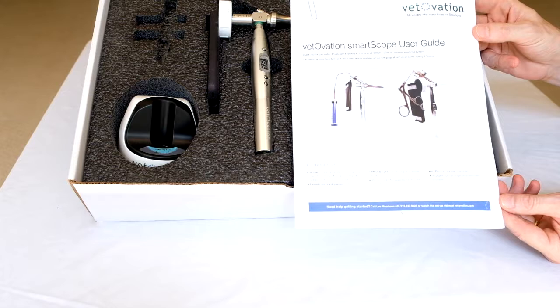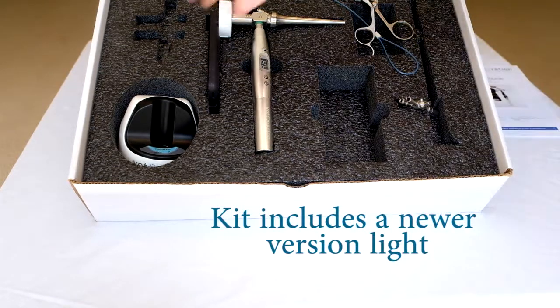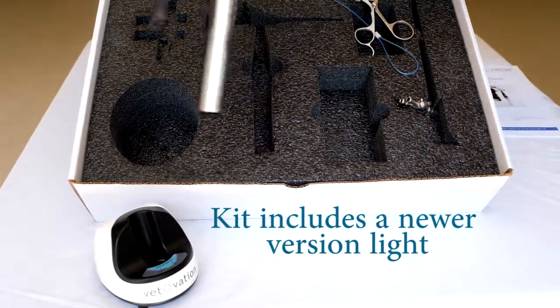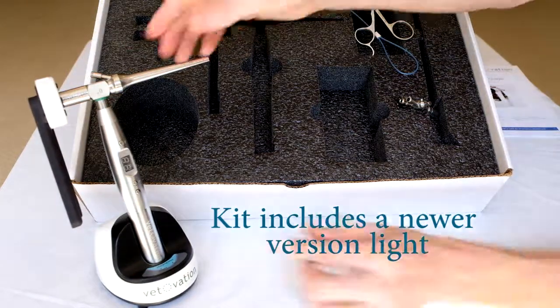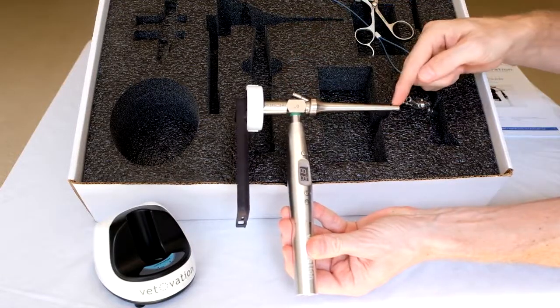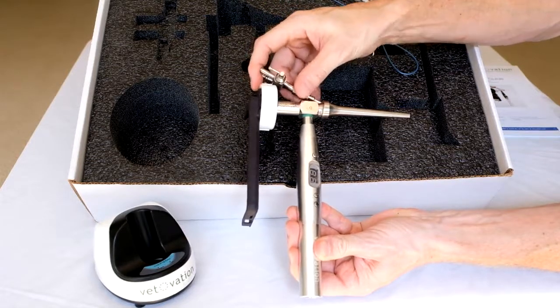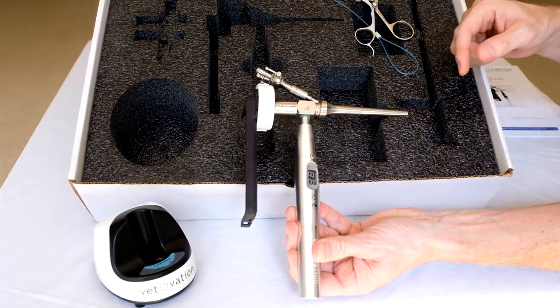you'll find a user guide that provides some frequently asked questions as well as tips for using the light and manipulating the app. Inside the kit, you'll find a charging base that your LED light will charge on. You have a reusable lithium battery inside the light. You'll also receive a scope that has a working channel, and a bifurcating adapter that hooks up to the top of your scope so that you can introduce saline from an IV bag or a standard lure lock.